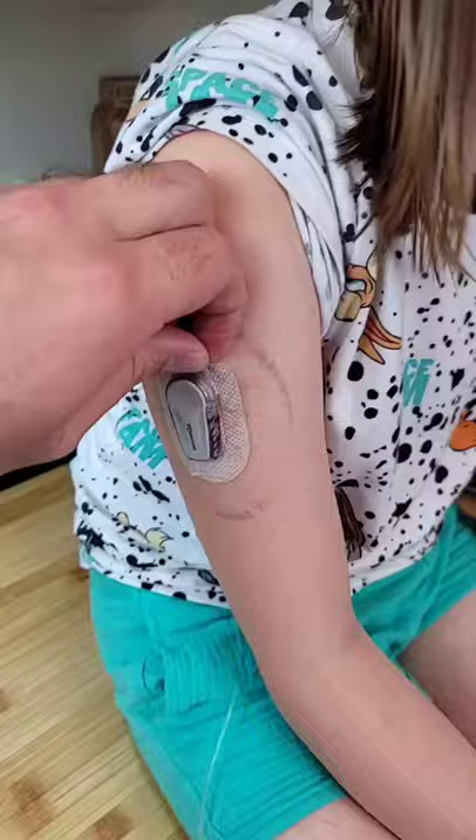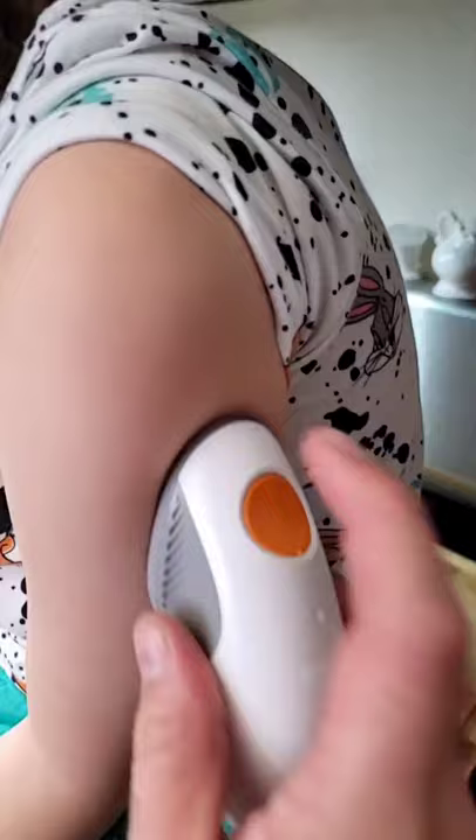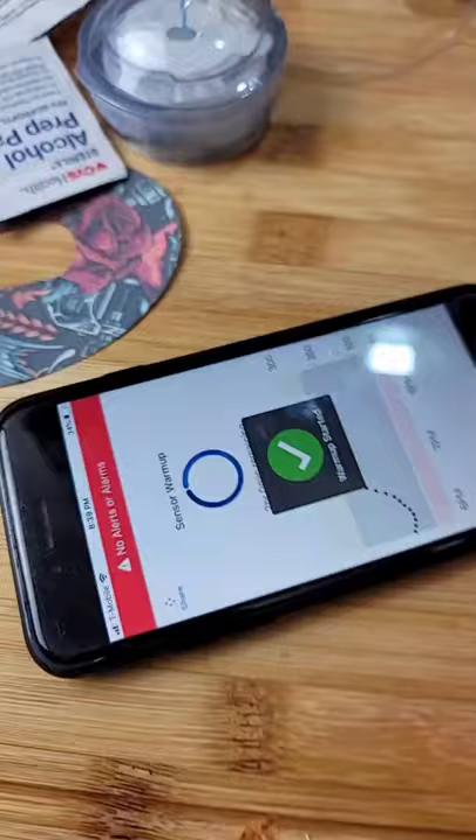It's Dexcom and T-Slim swap day. One, two. Alcohol swab. And attach. It's a bleeder — it means it's a good one. Start.